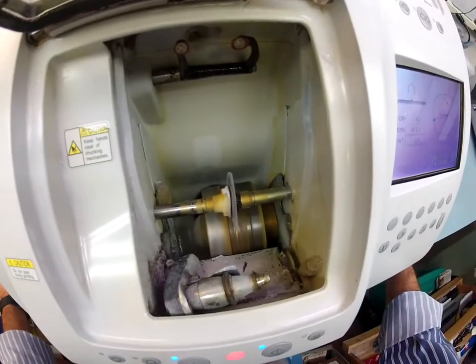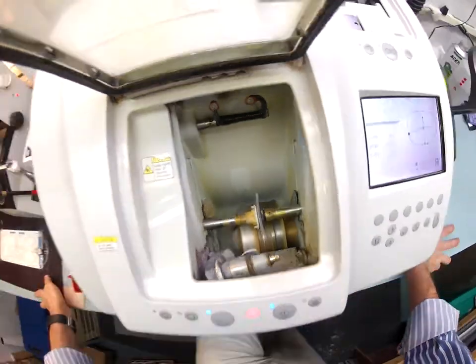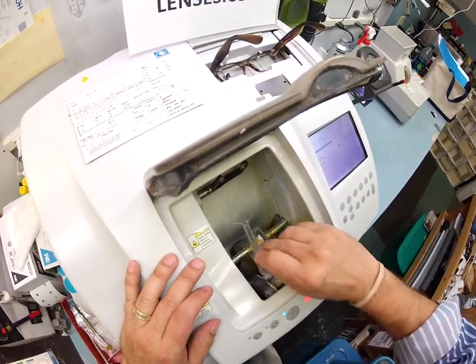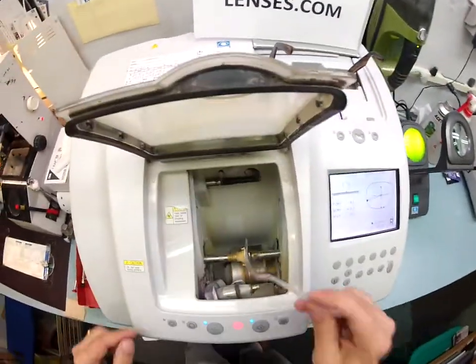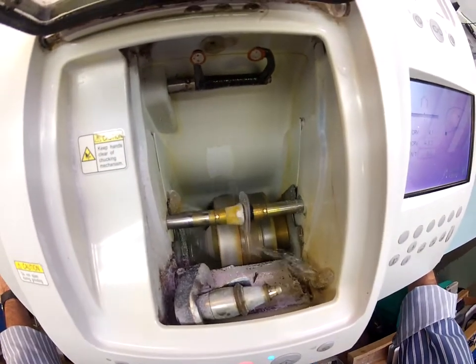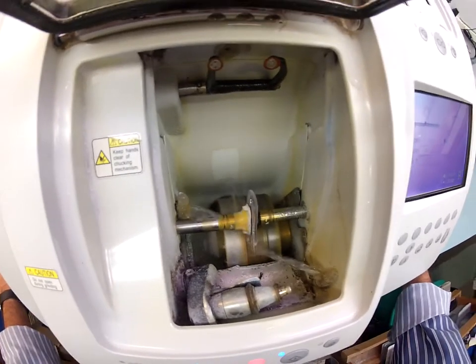Now, your lens has moved over and it's actually starting to put the bevel onto the lens now. And if you notice, there is water running in the background. If I get a very high-tech device, I don't know what this is called, I've seen them in certain places, you can see water running in the background. In just a moment, water's going to kick in. There's little jets that are going to start spraying water onto the, oh, caught it, KGB-like reflexes. And that's it, it's just cleaning away any optical debris, which is a little bit of waste, because as soon as I take it out, I'm going to put more on there.